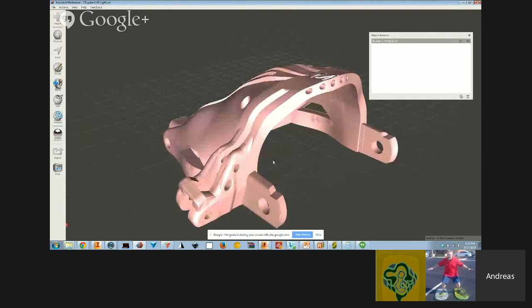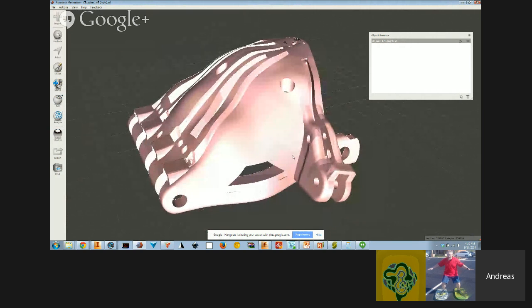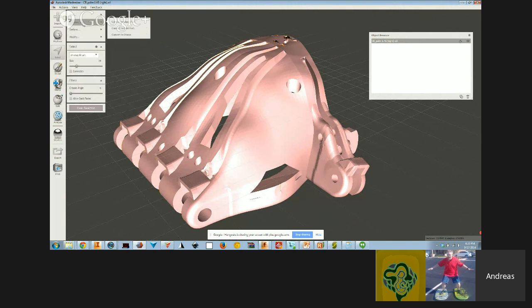Now, you see it's pink. This is because the normals are inverted. So I can invert the normals of the faces first. That's probably the first thing I'll do. So if I go to select, I want to select all. And rather than paint selecting, because they're all reversed, I just hit Control A. All my faces get selected. There's probably another way of doing that.